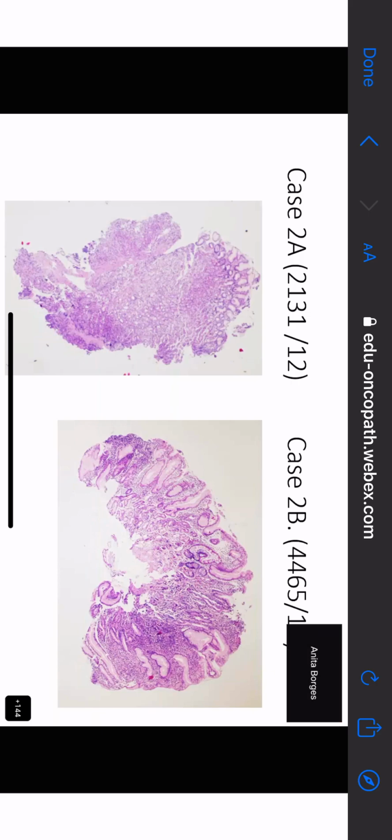They don't look alike, okay. Can you see the muscularis mucosae? No, ma'am. No, you can't. So really, you cannot assess whether the glands reach right down to the muscularis mucosae, because the muscularis mucosae tells you the thickness of this gastric mucosa.